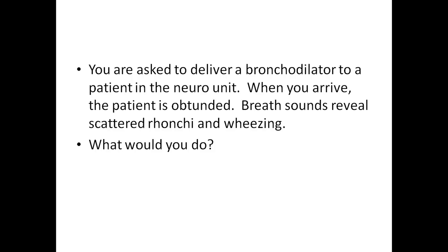As we're assessing this patient, we'd also want to determine whether or not the patient could use a mouthpiece or if we should give a mask treatment. Most likely, if they're unable to follow instructions, a mask treatment would be more appropriate. Continue to review the clinical practice guidelines and think of other patient scenarios that would sway you one way or the other using the different delivery devices.